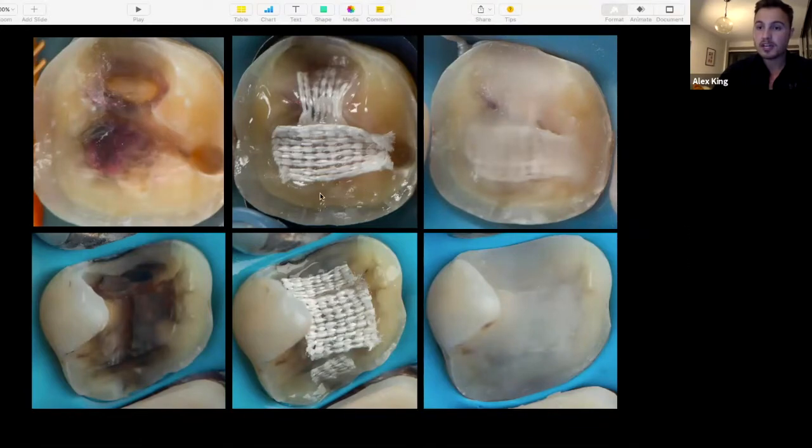Obviously, we're not going to have this routinely, this Ribbond stuff. However, fiber reinforced composite does exactly the same job, studies have shown now. So either or both if you can afford it really in practice. But for dental school, I won't be worrying about this. I'd be just trying to get a nice bio base with a bond, flowable composite 0.5 millimeters and 1 millimeter of actual dentine replacement composite within, and allowing that to rest for 5 minutes.